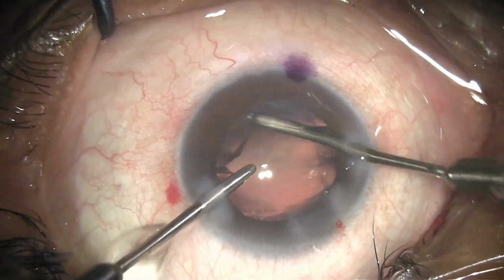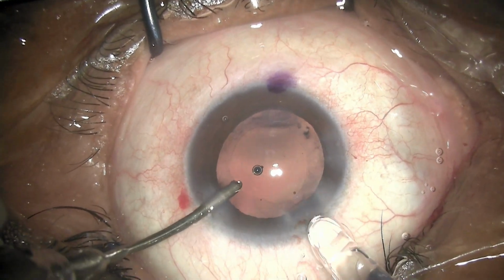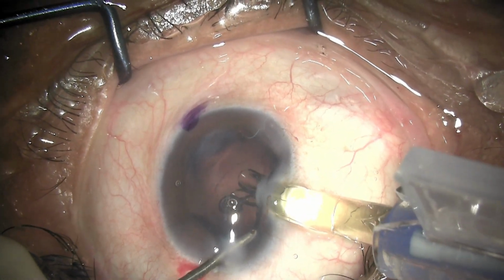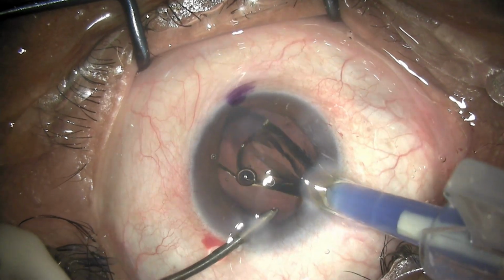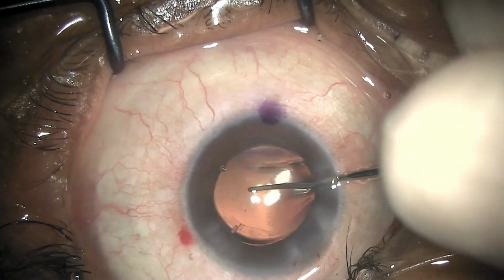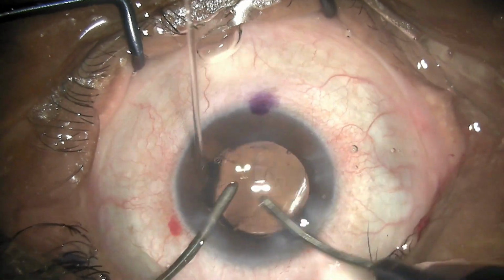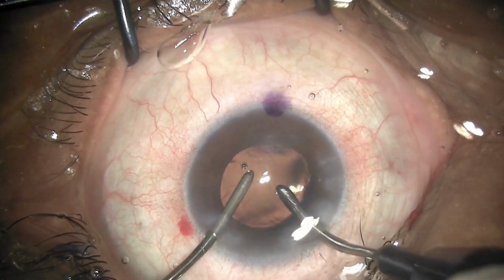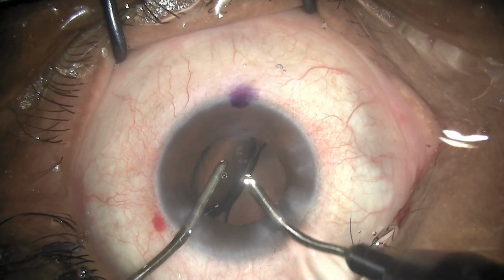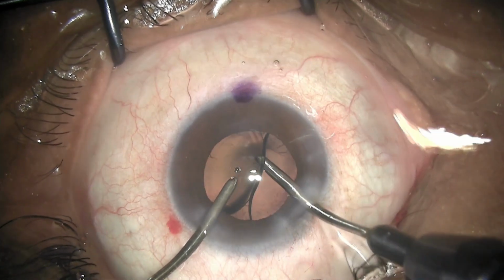So once the cortical cleanup and the polishing of the anterior lens capsule is done, it's time to implant the Ultima Smart Toric lens. So this is wound assisted 2.2 millimeter incision, and you can see this is a plate haptic lens which is now dialed into the bag. And now, before I put on the marking system again, I'm just going to use the irrigation cannula and remove all the viscoelastic from behind the IOL by gently rubbing the IOL surface and depressing the wound.